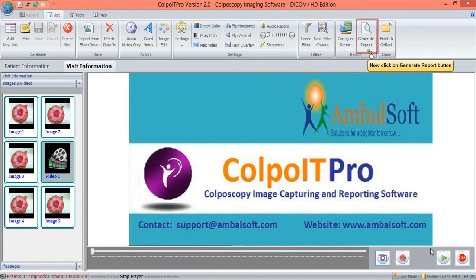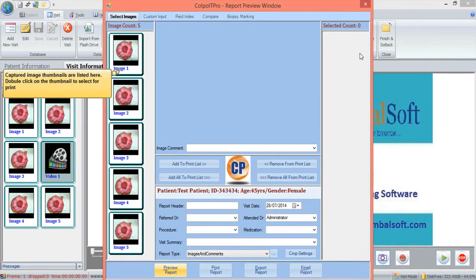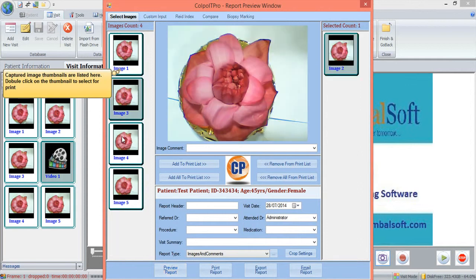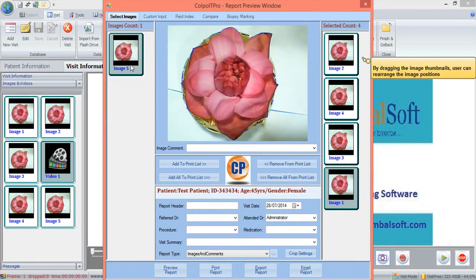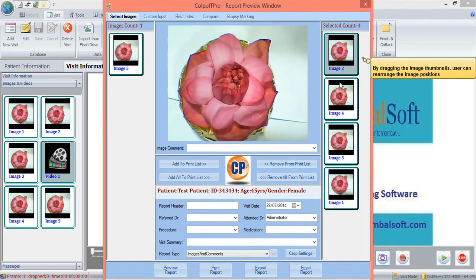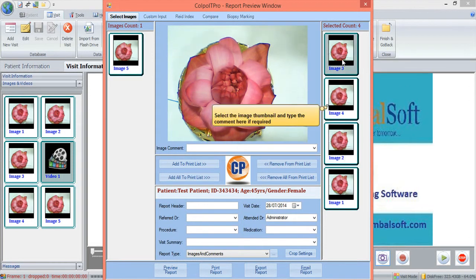Click on the Generate Report button. The captured image thumbnails are arranged on the left side of the preview window. Double click on those images which need to be included in the final report. Drag the thumbnails to rearrange them. Type in a comment for each image thumbnail if required.